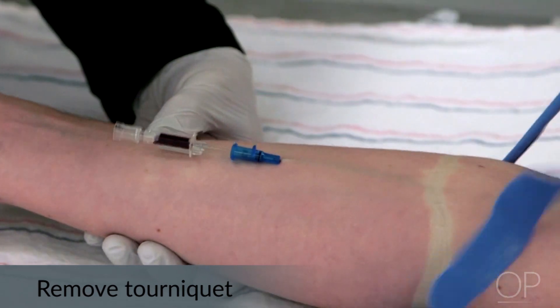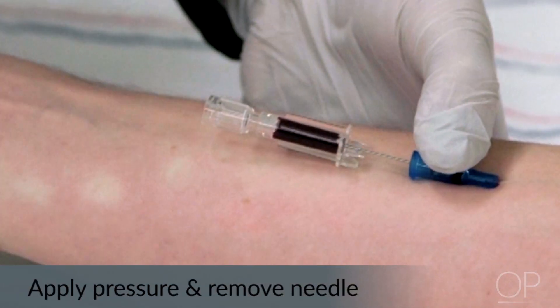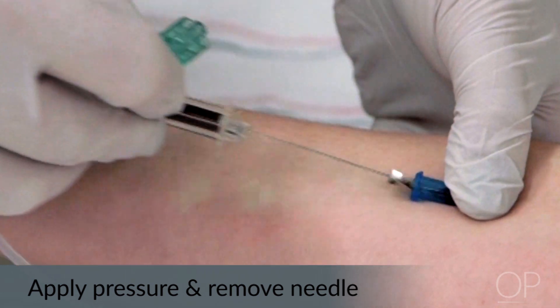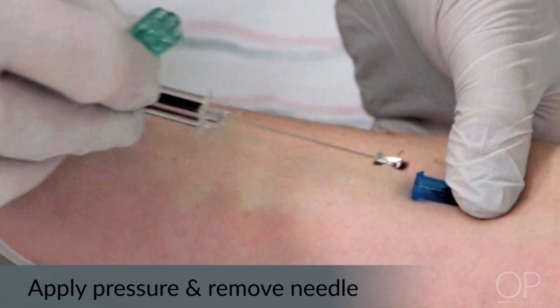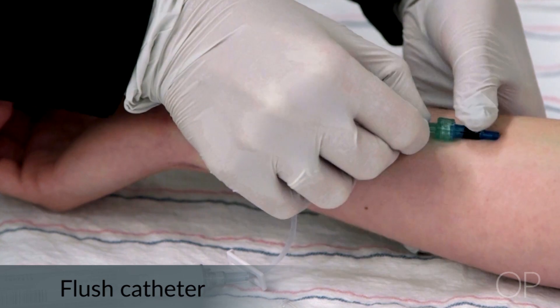After advancing the catheter, remove the tourniquet. If possible, apply pressure above the insertion site and remove the needle. There should still be blood flowing back indicating that the catheter is in the vein. Secure your sharps, attach the connector, and flush the catheter looking for infiltration.